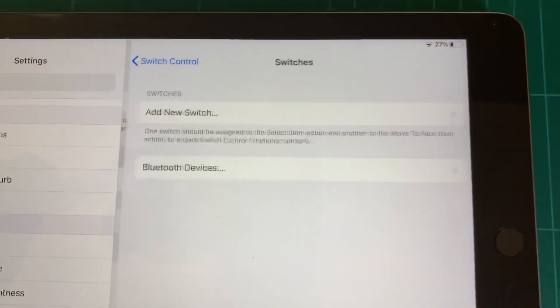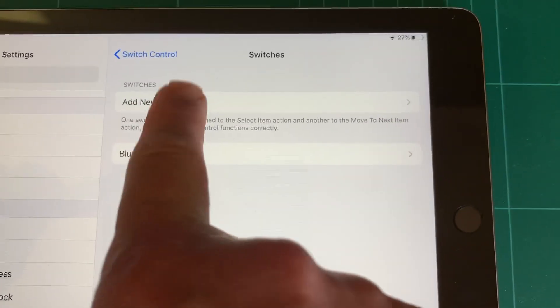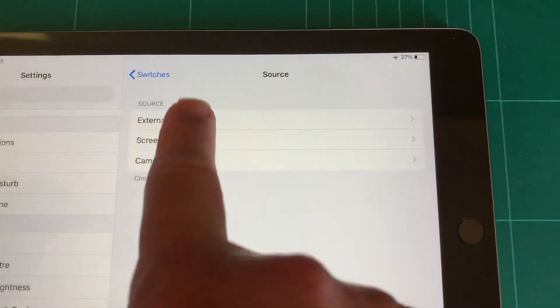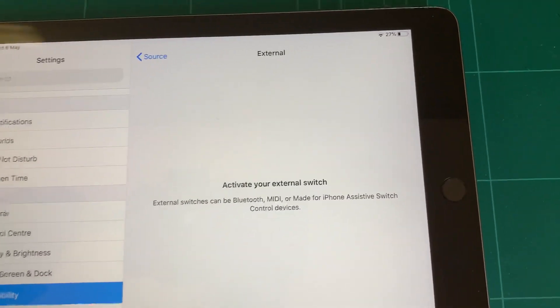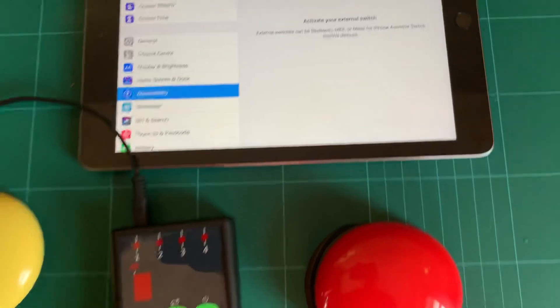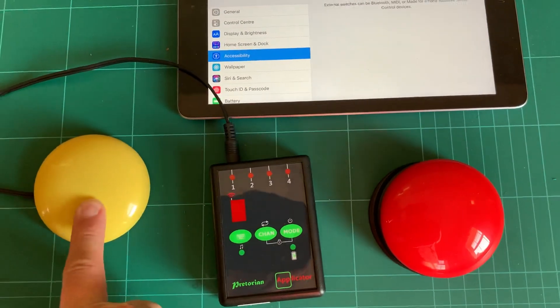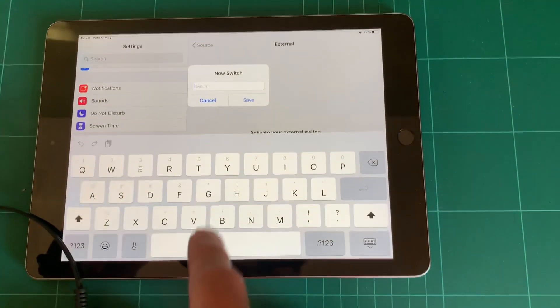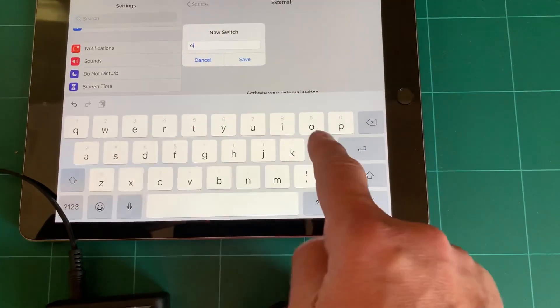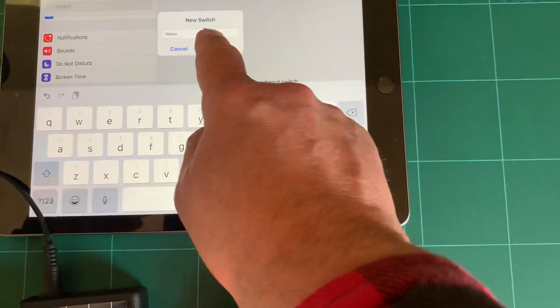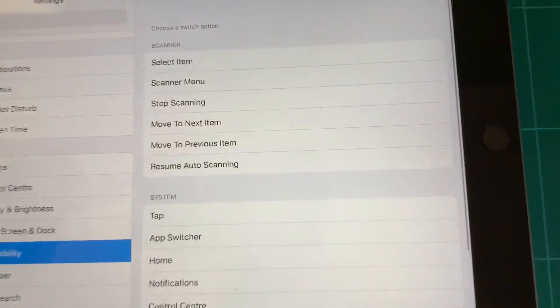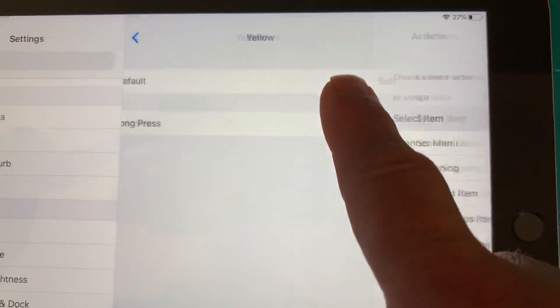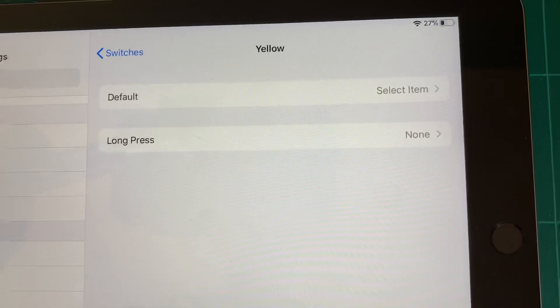So I'm going to tap on that and then add a new switch. It's an external switch, and it then asks me to activate the switch. I'm just going to press the yellow switch there, and it asks me to give it a name. I could call it anything I like, but I'm just going to call it Yellow and save that. Here's the important bit: you need to make it set to Select Item.